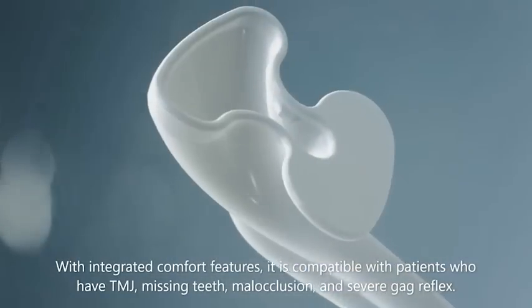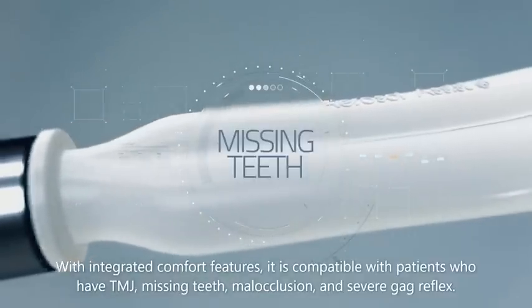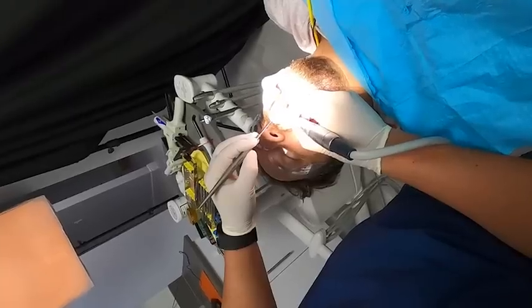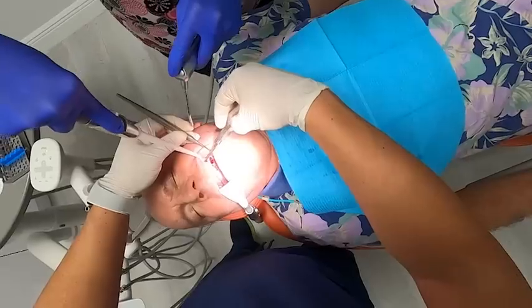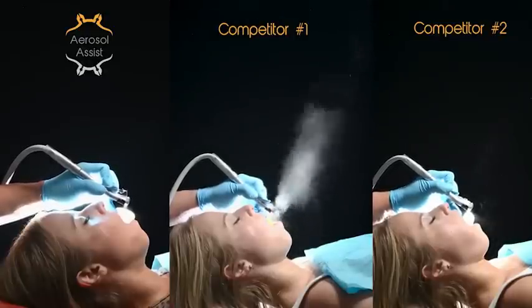The aerosol assist is able to treat patients with limited ability to open, TMJ issues, pharyngeal or gag reflex, and is the go-to choice for prophylaxis, SRPs, anterior restorations, crown cementations, endodontic procedures, procedures that use a rubber dam, implant placement, and second-stage surgeries and extractions. At around 30 cents a use, it is the most affordable option because of its reusability.